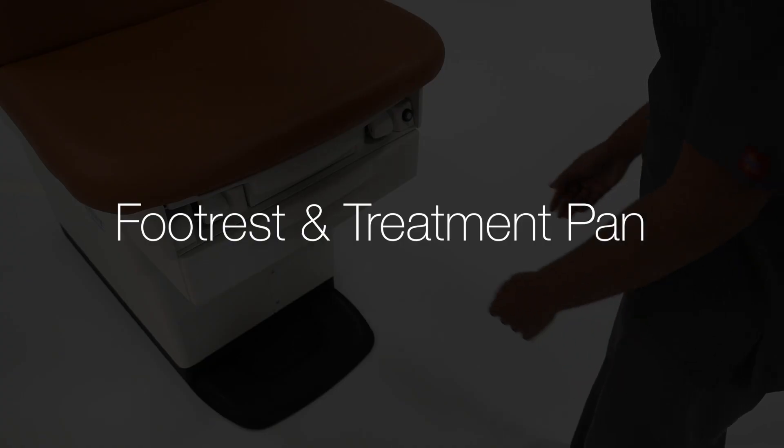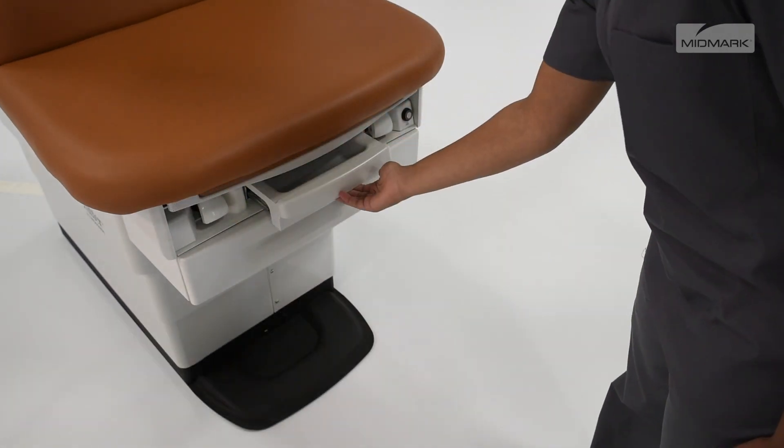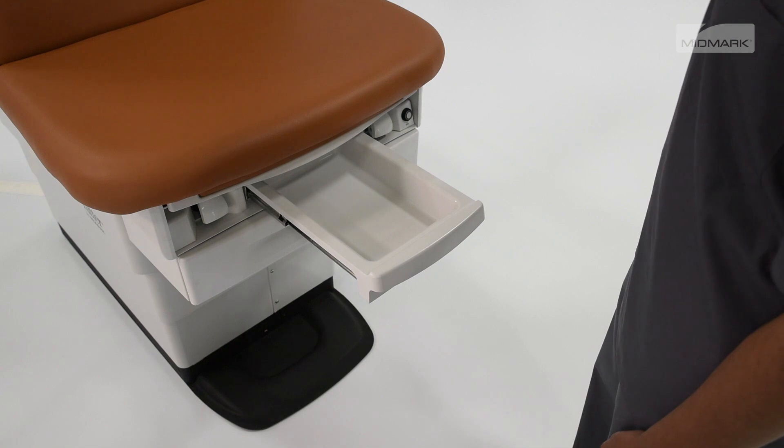To extend the foot rest, pull the foot rest out to the desired position. To access the chair treatment pan, pull the treatment pan out to the desired position.